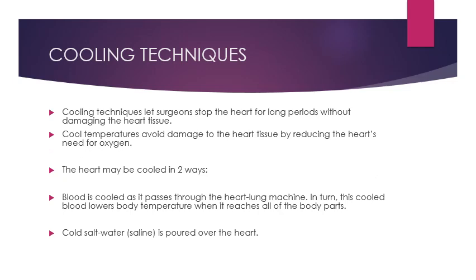There is a technique called the cooling technique. This technique lets surgeons stop the heart for long periods of time so that they get enough time to perform their surgery without damaging the heart tissue. Cool temperatures avoid damage to the heart tissue by reducing the heart's need for oxygen. The heart may be cooled in two ways. Blood is cooled as it passes through the heart-lung machine. In turn, this cooled blood lowers body temperature when it reaches all of the body parts.